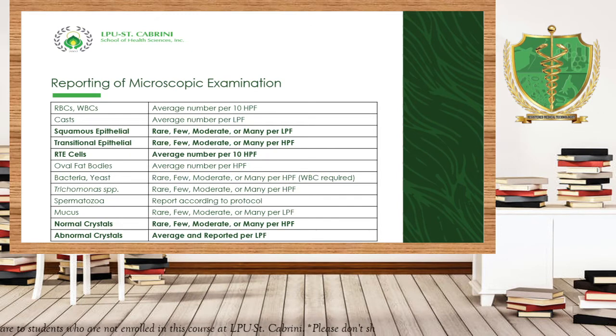I still remember what is stipulated in the book, according to Strasinger: urine may or may not contain bacteria. Bacteria in the urine may be due to external contamination, or it is really pathological if it originates in the lower urinary tract.